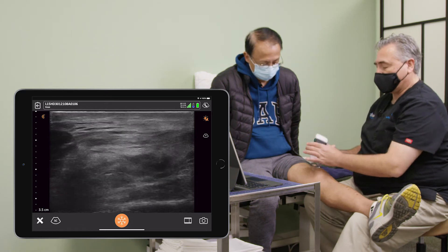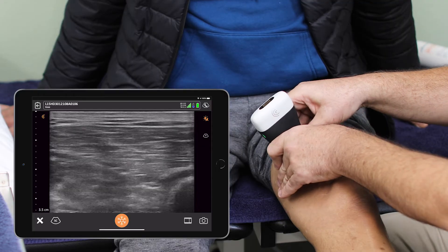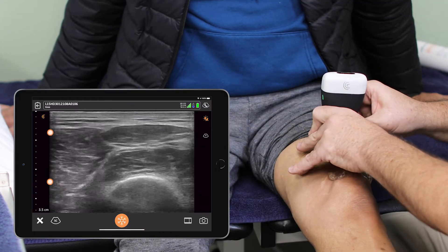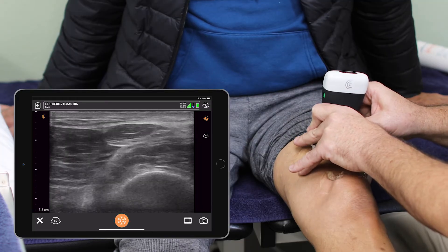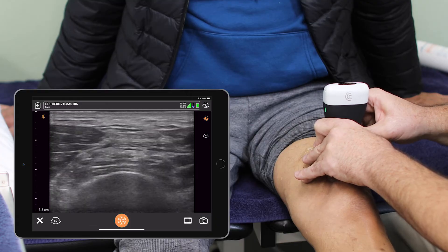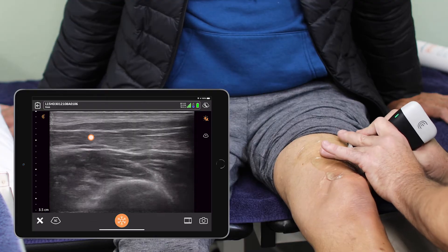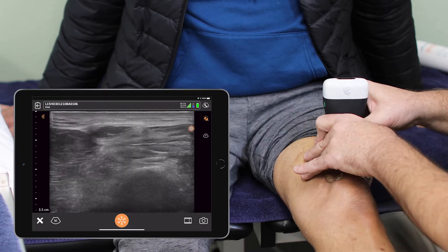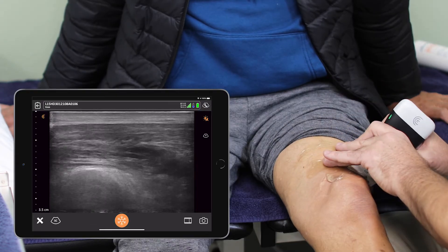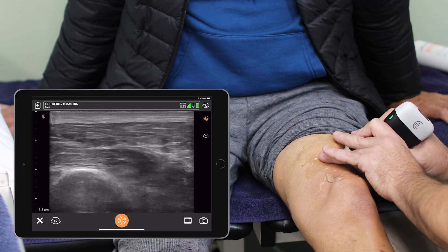I'm now going to go to short axis, coming up here a ways, and I'm going to be looking at the cross-sectional fibers of his quadriceps. This is the vastus medialis. We're now looking at the rectus femoris going from the muscle state to where it's the tendon state here. I'm going out to see the vastus lateralis and the one below, which is the vastus intermedius. All of those show me that he has been active — I don't see any focal area of fatty infiltration.